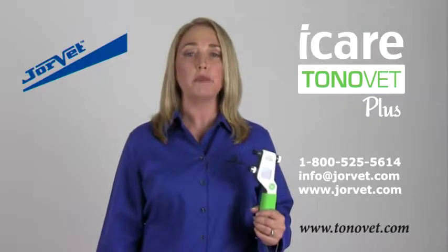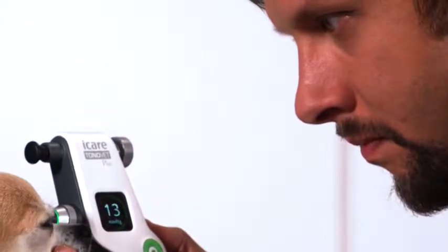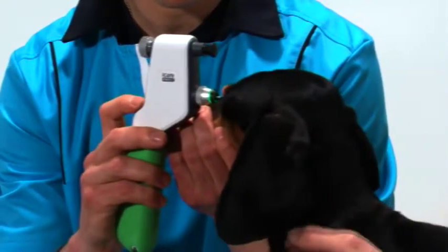The new ToneVet Plus offers many new features. The user-friendly display is more informative and easier to navigate. Indicator lights will actually guide your measurement without having to worry about the angle.